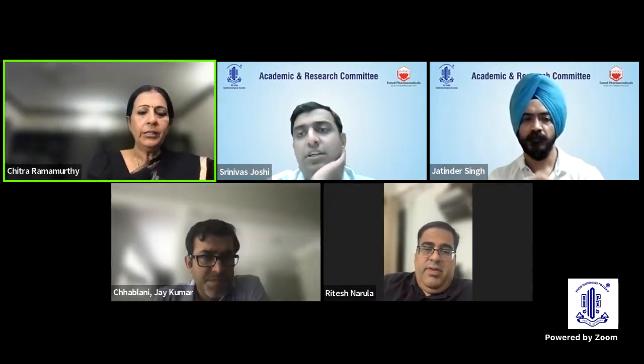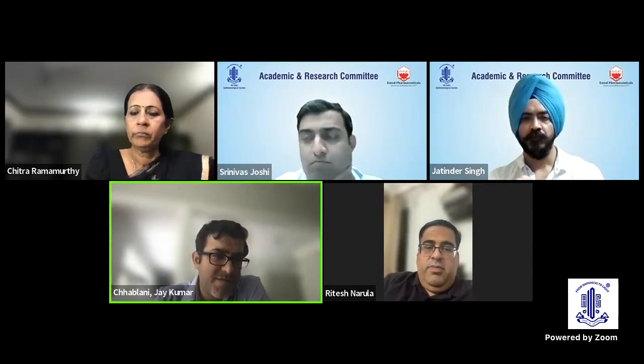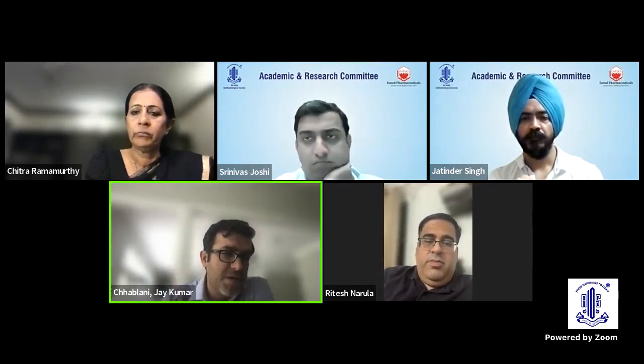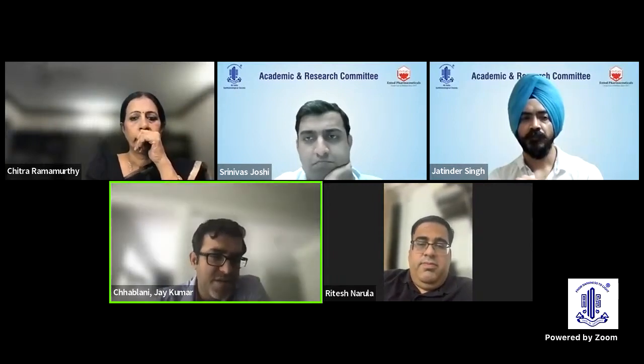Thank you. Dr. Jay, quick comment and we can move on. Nothing to add. I agree that it's almost impossible to differentiate unless you change the level of the segmentation. Then you may be able to see how they are located, as per the differentiation Dr. Jatinder explained.